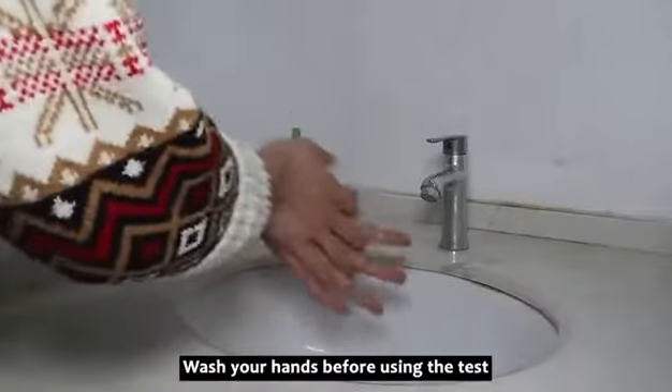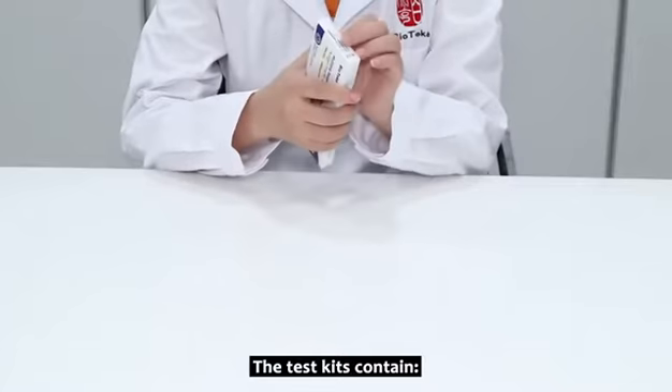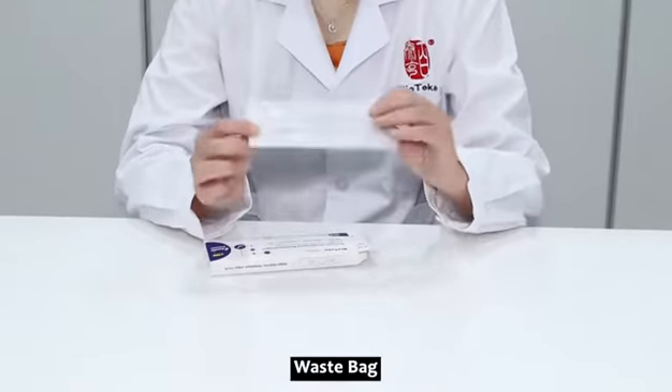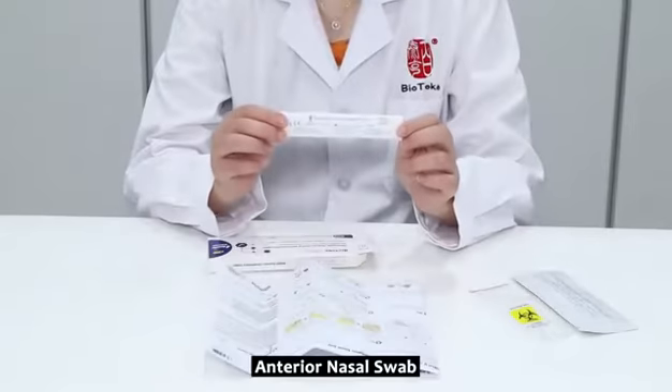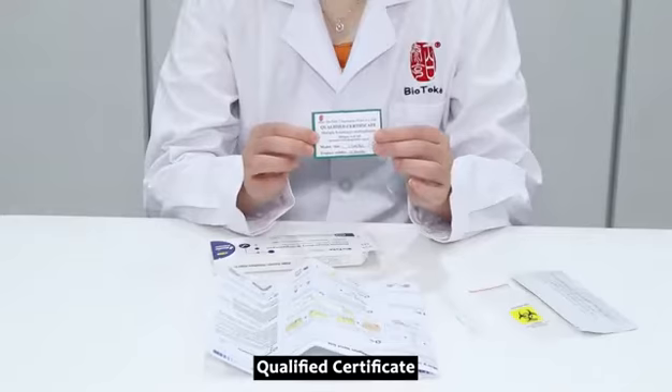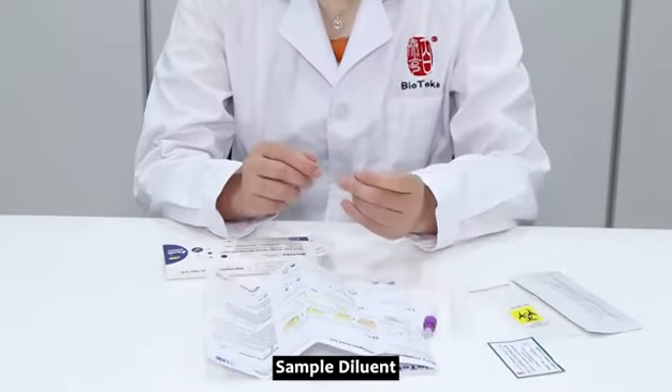Wash your hands before using the test. The test kit contains a test card, waste bag, instruction manual, anterior nasal swab, qualified certificate, sample extraction tube, and sample diluent.